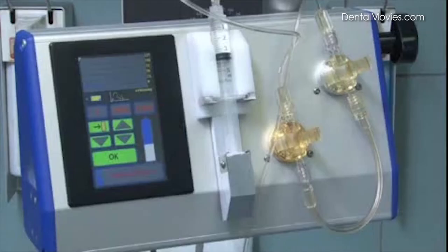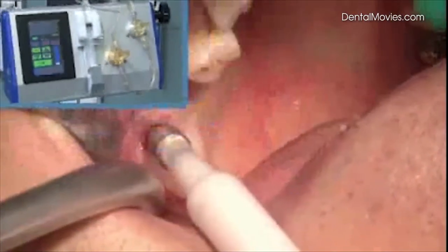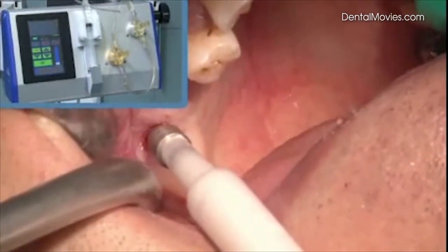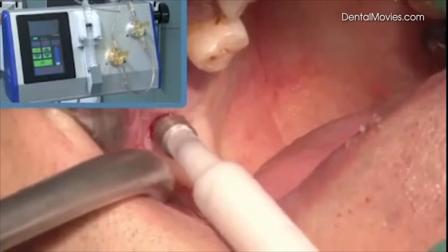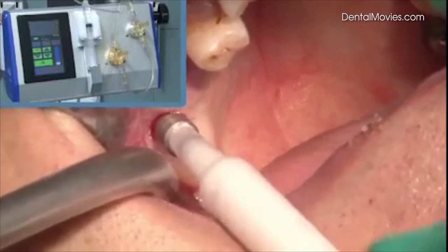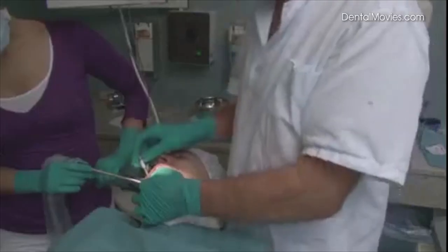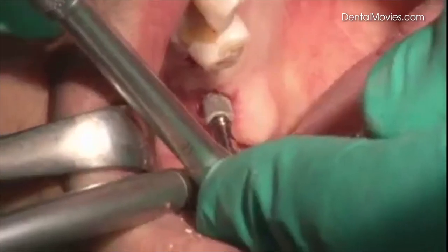When the membrane is sufficiently lifted, the saline solution is extracted using the Yader pump. The bone grafting material is then inserted. Since the bore is narrow, a paste-like bone grafting material — for instance, Ostim — is used. Finally, the implant is set into position.